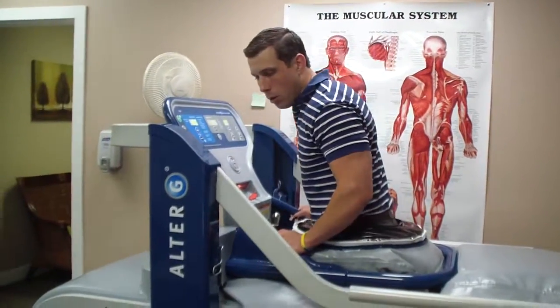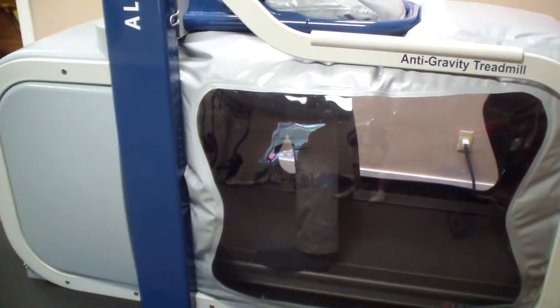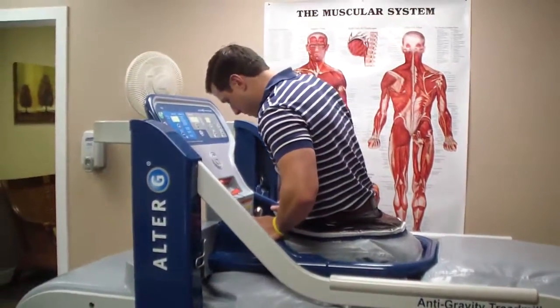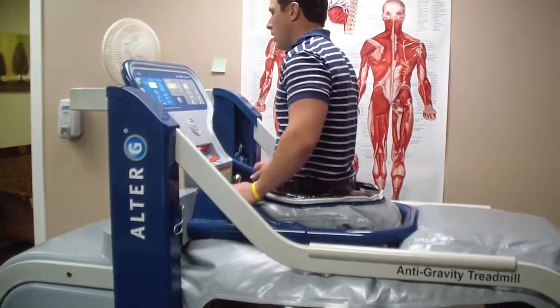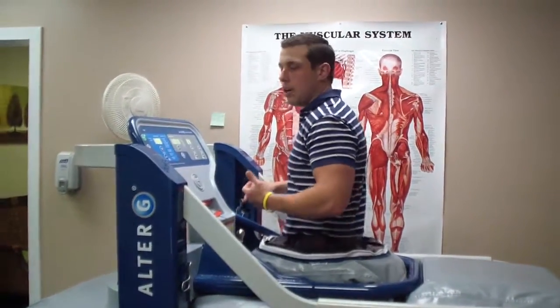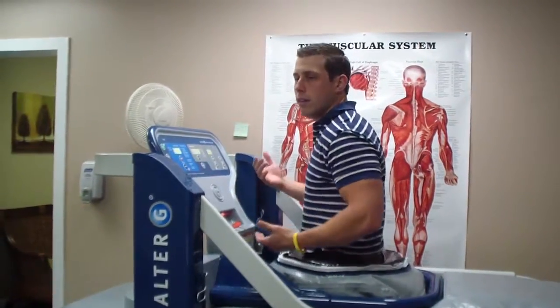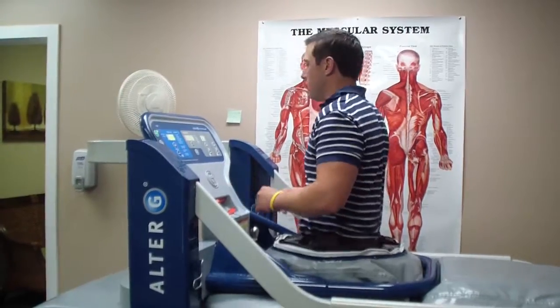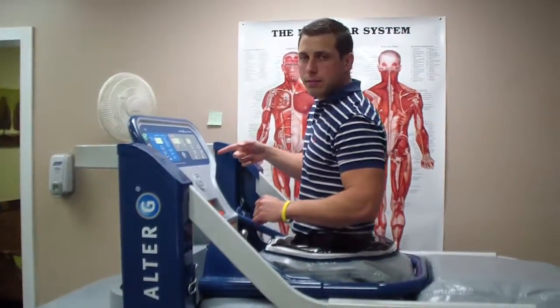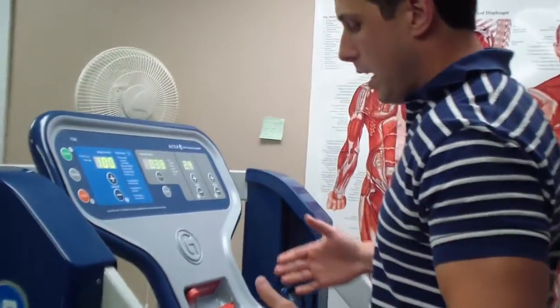Now we're all set. We'll open up our feet to the side and start the treadmill. There's a little window here so people can look down and find their feet. I usually have people walk at a decent clip for a little while just to get used to being here, because it feels a bit weird when you're zipped into a machine. We're also able to incline and run up to 12 miles per hour. It has a reverse for backpedaling, and you can also turn laterally into a side shuffle either way.